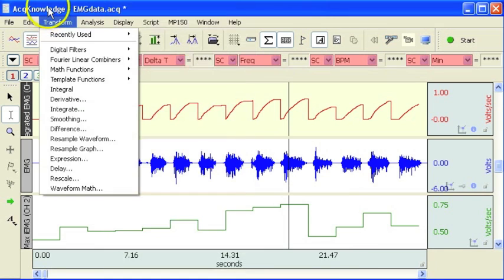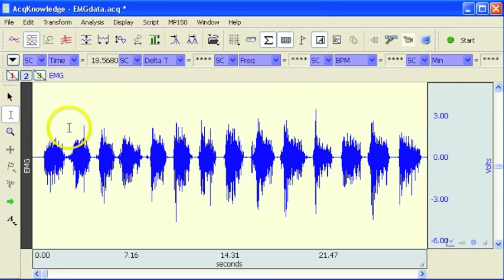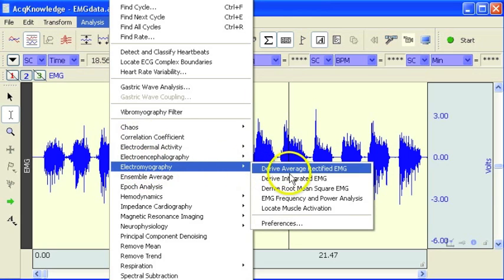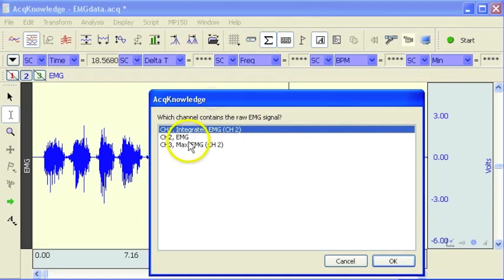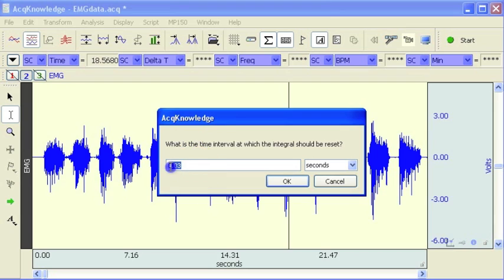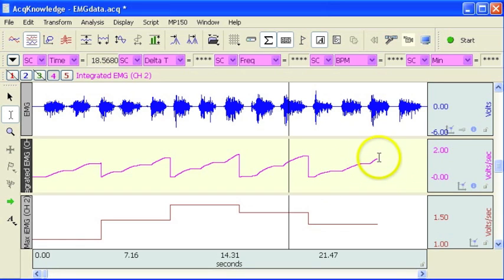I'm going to close out these two so we're back where we were, and run the analysis again. I'll select our raw waveform. This time I'm going to use a longer time window for the integrator before it resets. So now we can see over a 5 second period, and this ended before the 5 second reset.